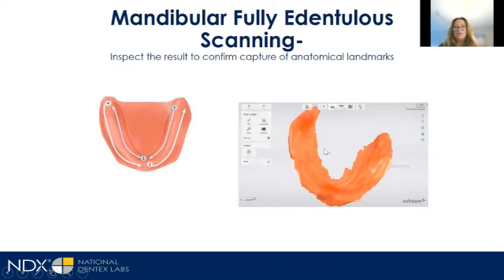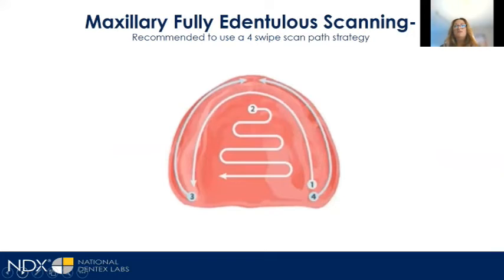And what I like to do after I capture it, I like to look at it in the model form. So I will look to make sure I have everything captured and no holes. And if you have holes, you can just fill it in a little bit. We've come such a long way with scanning. So you will get it down.